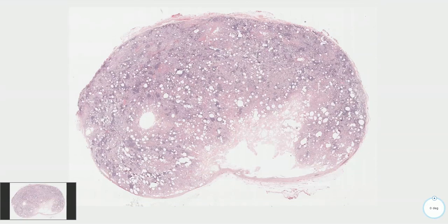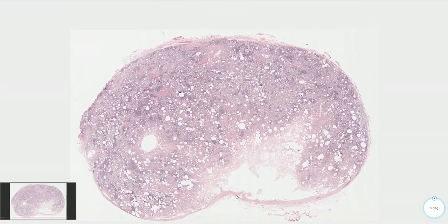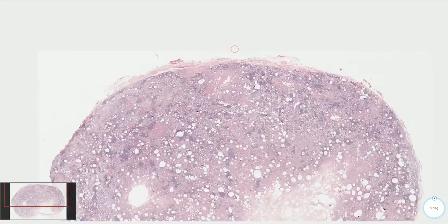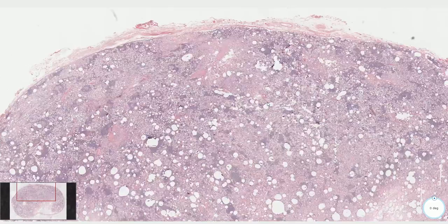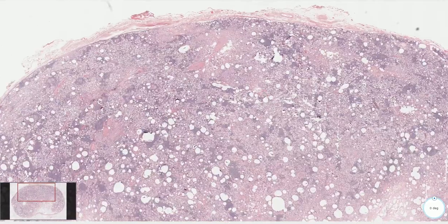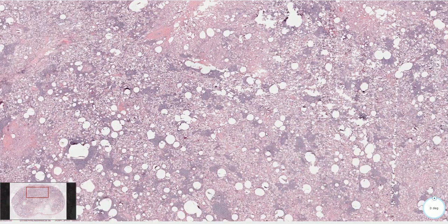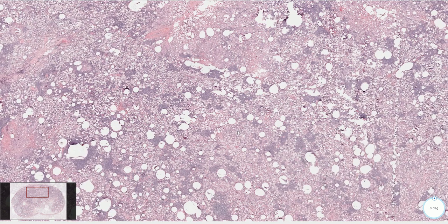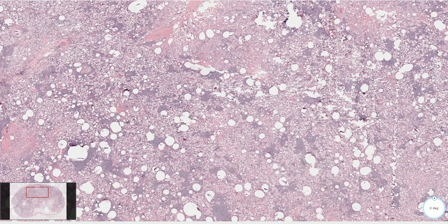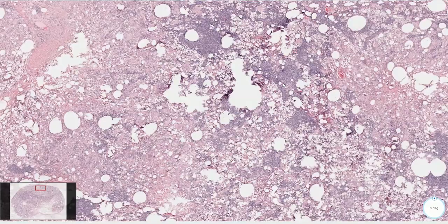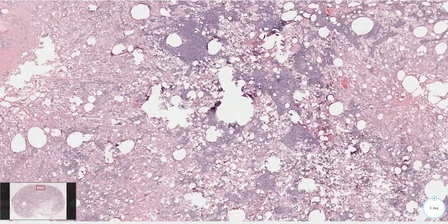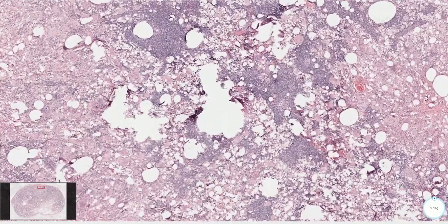Here we have a lymph node with a nice smooth thin capsule and patent subcapsular sinus. This lymph node is infiltrated by some type of foreign material, and here we have only residual islands of lymphoid tissue composed of lymphocytes.